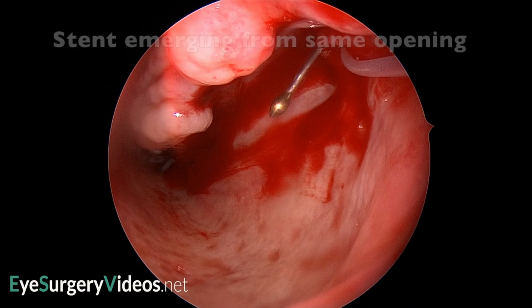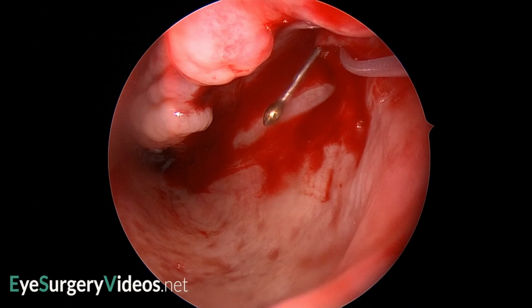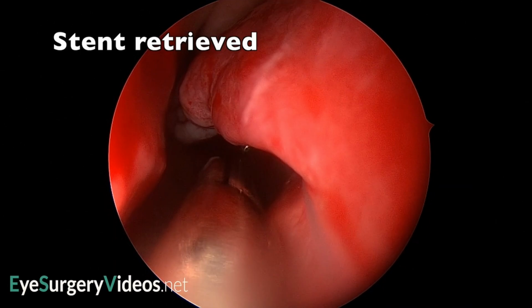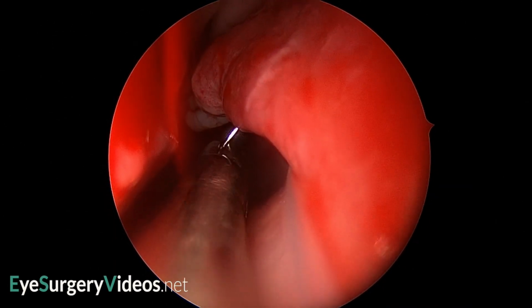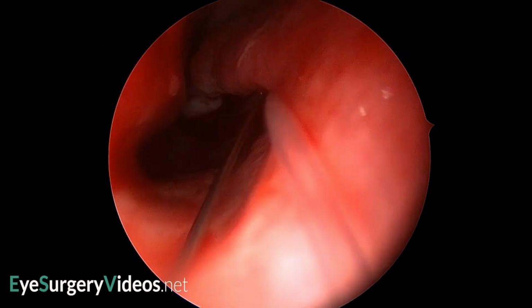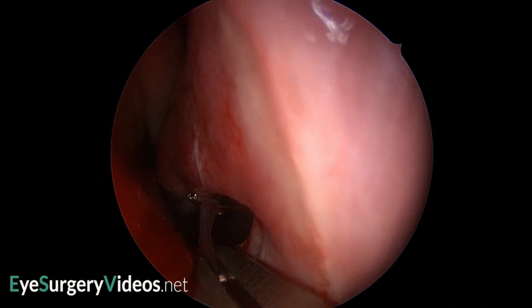Placing a stent under vision using an endoscope allows for early detection of this complication if it occurs, and hopefully modification of the direction of the passage to stay within the lacrimal drainage system, avoiding any further trauma, and ultimately conducting a procedure that will have the chance of a successful outcome.